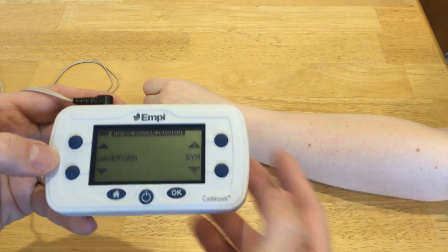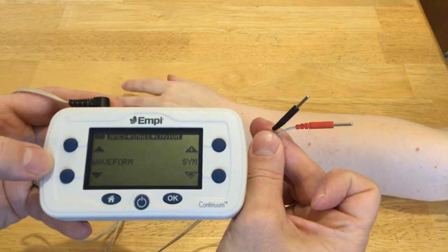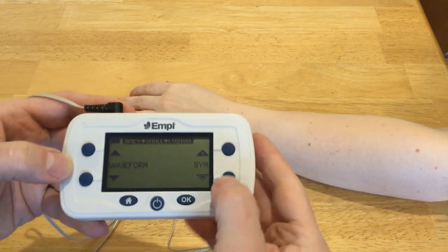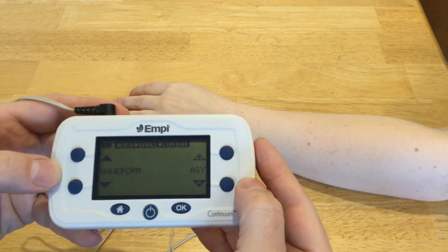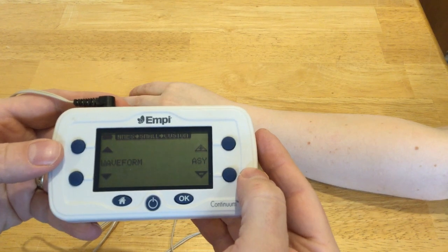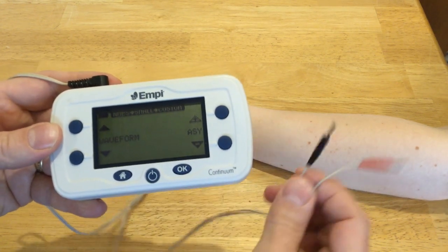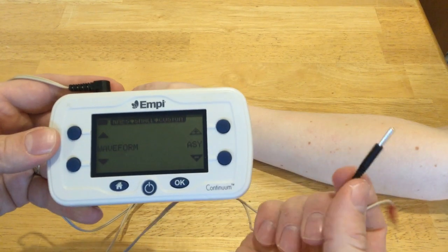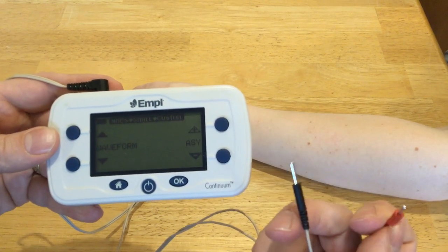With a symmetrical waveform, the colors won't matter at all. If you use an asymmetrical waveform, you do have a primary cathode and a primary anode, and the colors do matter. In that case, the black will be your primary cathode — the one that is more active than the red one.